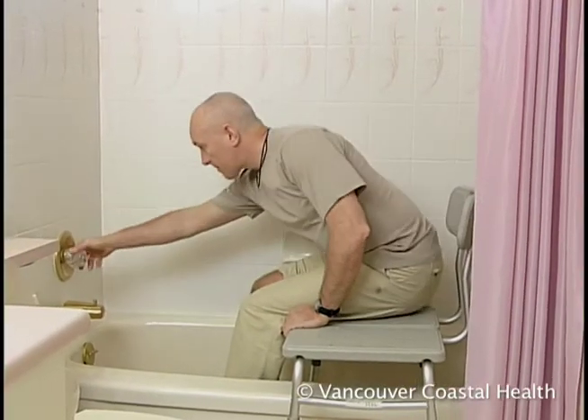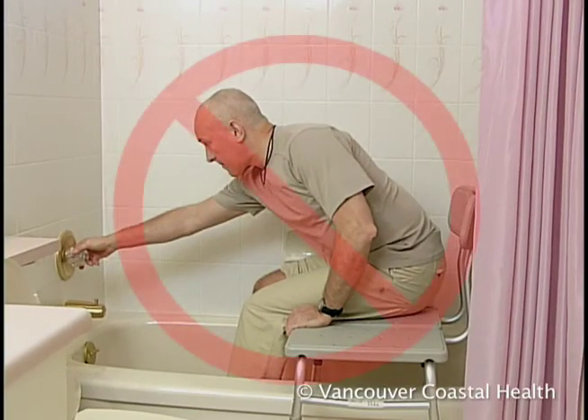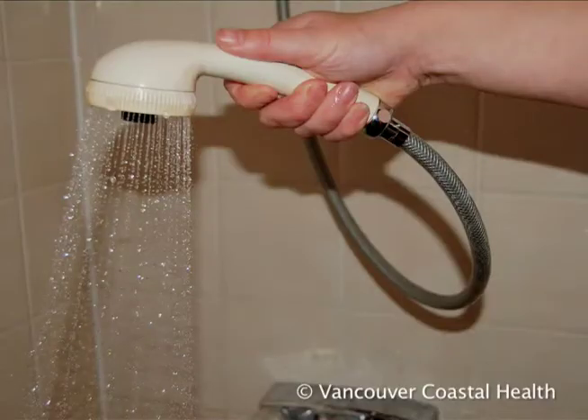Don't reach forward for the taps if you've had hip surgery, because this breaks hip precautions. To avoid leaning forward, attach a hand-held shower hose to the bench and turn the water on before getting into the tub.